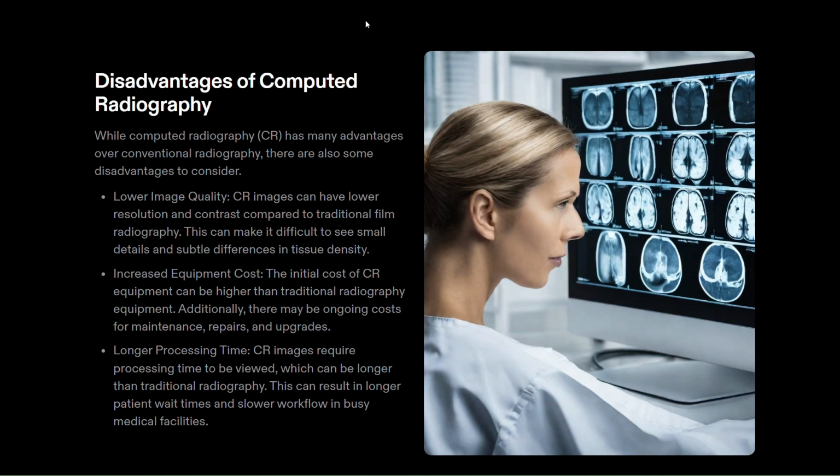The processing time will be longer. CR requires processing time before the image can be viewed, which can be longer than traditional radiography. This results in longer waiting times for patients and a slow workflow in busy medical facilities.